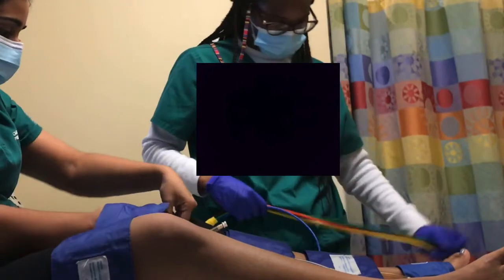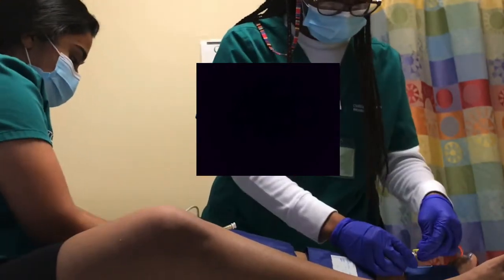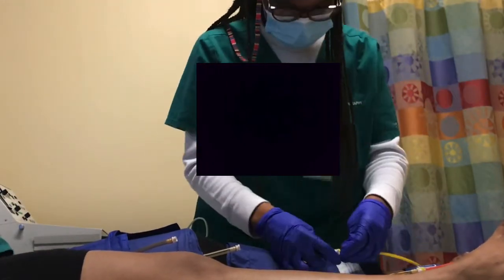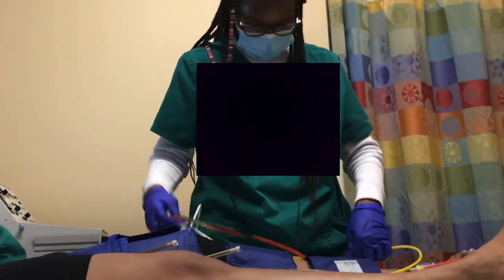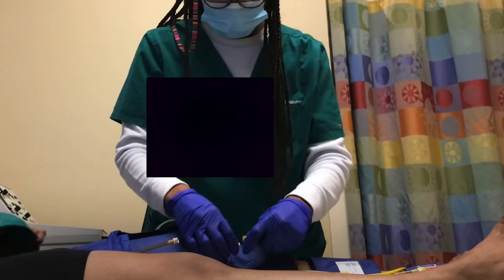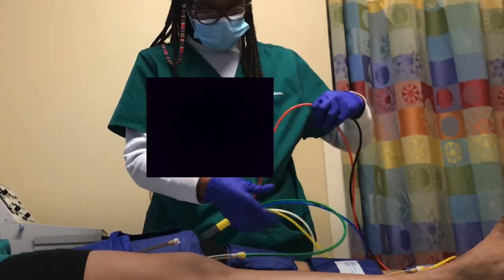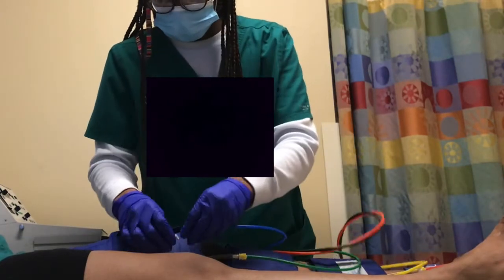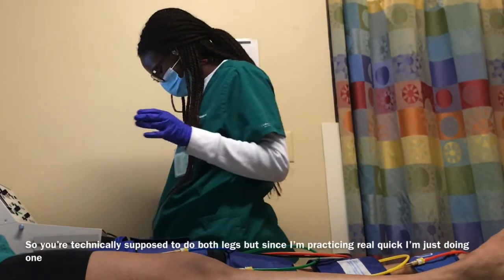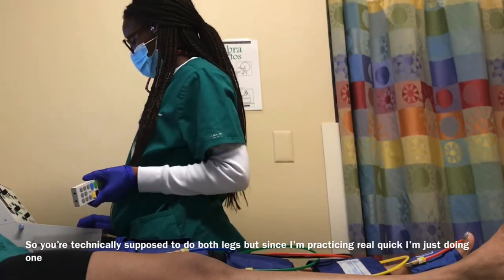It's the best that I've had this time around because last time I was by myself, so it's really beneficial for both of us. We haven't had much time to practice an echo because echo is very busy, but vascular is just awesome. So yeah, right now we're doing a PVR. I'll link down some videos with better descriptions of what a PVR is because I'm not really a teacher so I'm not really good at explaining stuff, but this is a PVR.